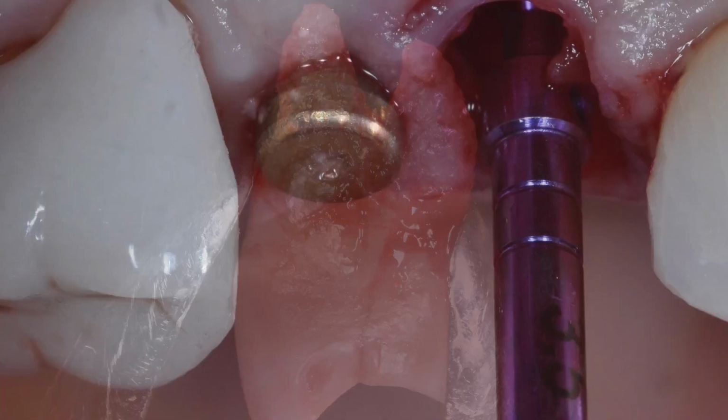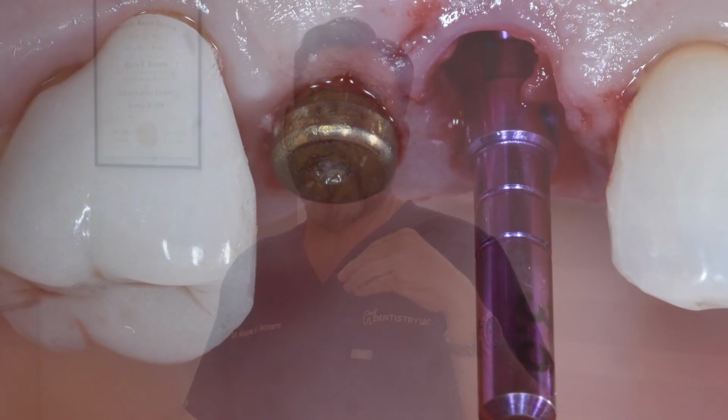I'm going to extract the tooth, and the actual alveolus that is available for me there, that's the guide that I'm going to be using. That's really the direction that I'm going to try to follow in order to place that final implant. And I'll share with you a case like this towards the end of this video. But when am I going to use a fully guided protocol, which is what I think we should all be doing if there is an edentulous site or in our more complex cases.